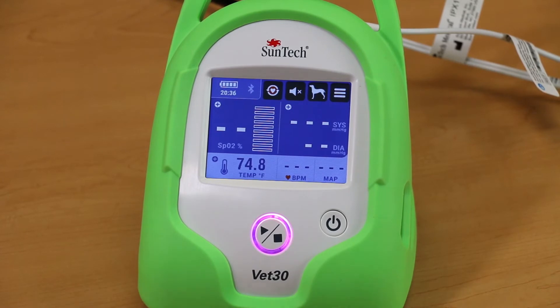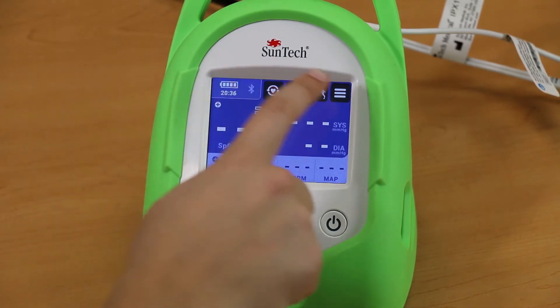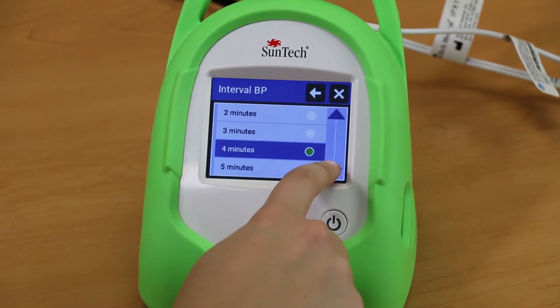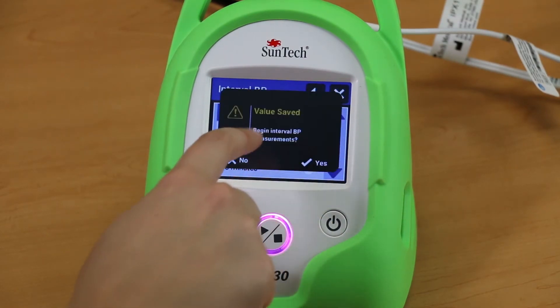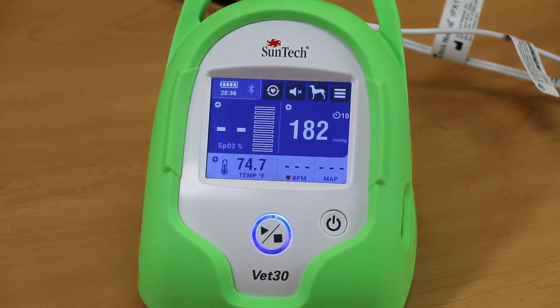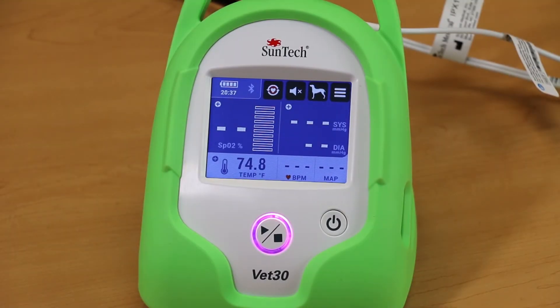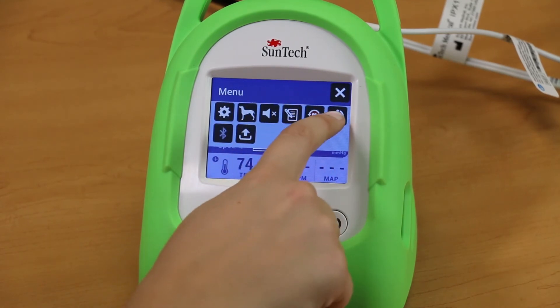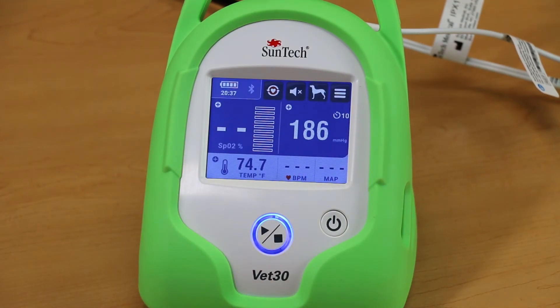To set up Interval BP mode, press the Menu button, then the Settings button. Select Interval BP and choose the time period you would like between BP readings. Once you have selected an interval time period, the VET30 will give you the option to immediately begin taking the first BP reading. Select Yes to begin right away, or select No if you would like to start monitoring later. Once you have set an interval time period, press Menu and then the Interval BP button to begin the first BP reading. Interval BP mode can be ended by pressing the Start-Stop button.